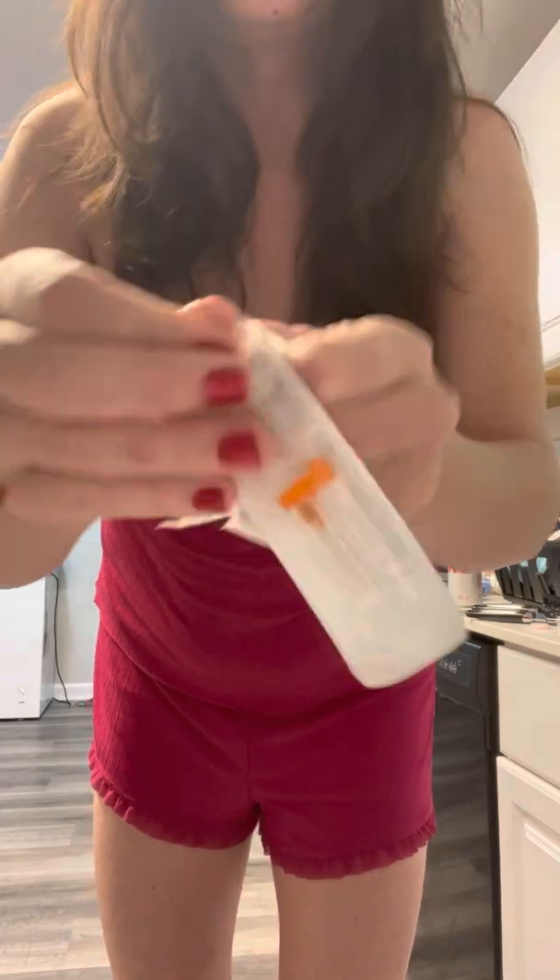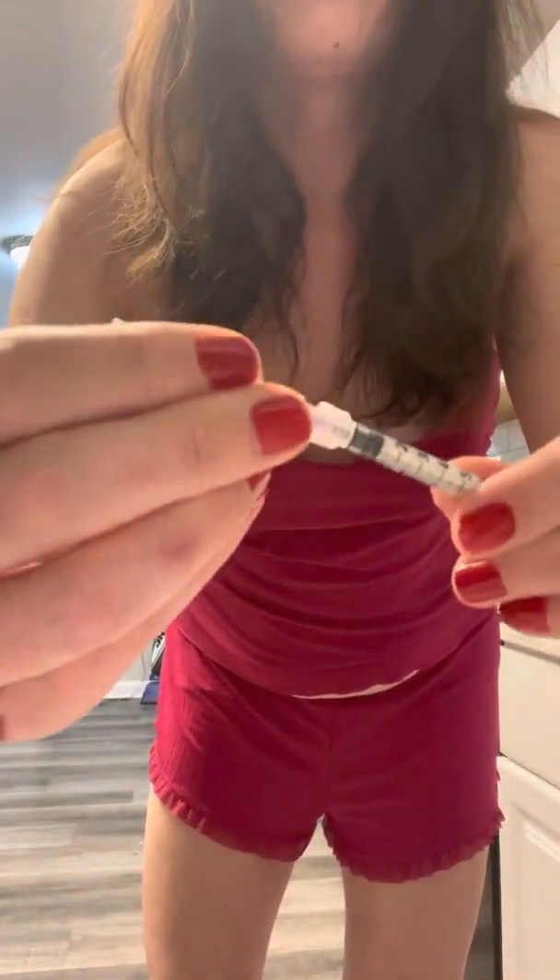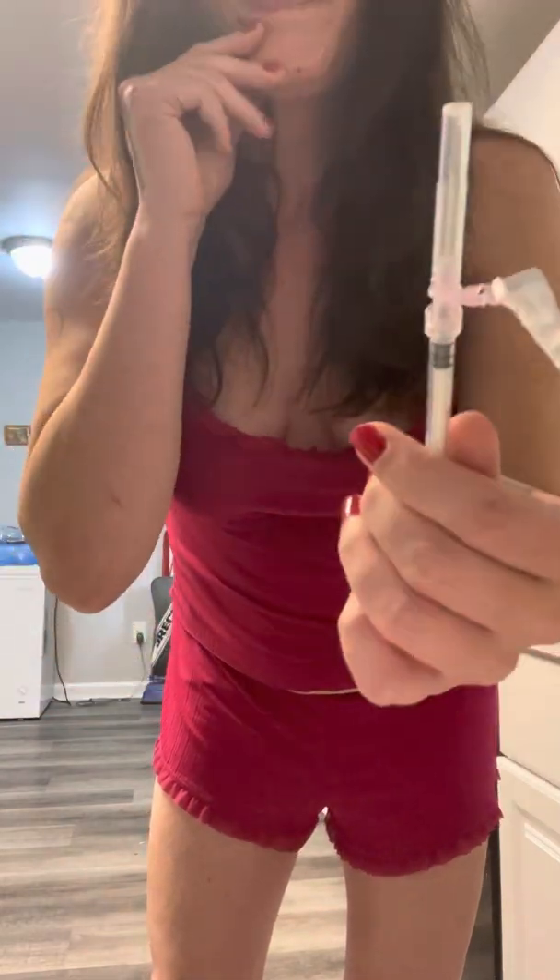This one is the larger needle — this is the drawing needle. This is what I will use to draw the serum, and then this smaller needle is what I will use to inject the serum. It is a subcutaneous needle, so this is not intramuscular — this is subcutaneous. You're basically transferring into your fat, not into muscle or veins, just straight into my fat. So I wipe the tip of my vial — it's nice and clean — and I go ahead and put on the needle for drawing.